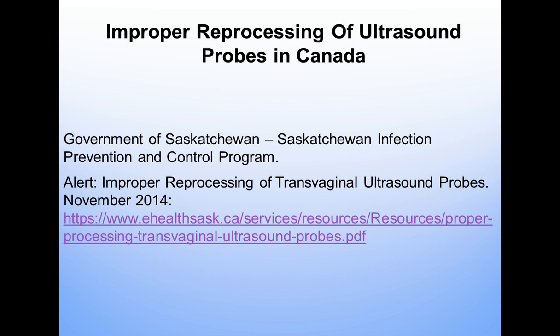Talking about if we don't follow our standards and our guidelines, then there could be possible transmission or cross-transmission to the client or to the employee themselves. But when you look at Canada, there has been some improper reprocessing of ultrasound probes in Canada. I know there's quite a few that are older. In the 1980s, there was one in Labrador with endocavity probes, and there's also been a couple in Canada, but a lot of these aren't widely publicized.